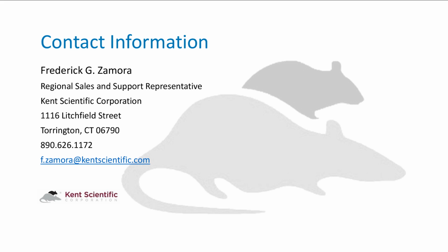Again, that might vary depending on the type of procedure you're performing, as well as even the setup that your SomnoFlow or SomnoSuite is in. So, sorry, I can't give you an exact value there, but you'll have to play around to see what works best for you.